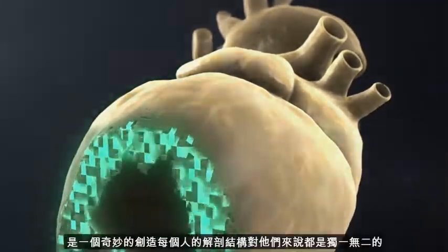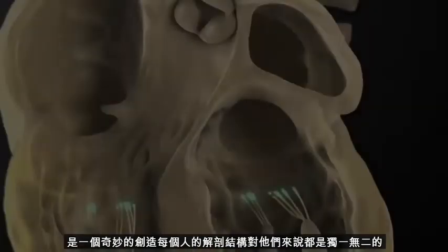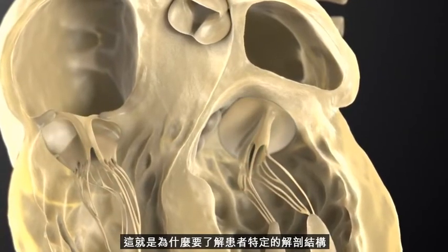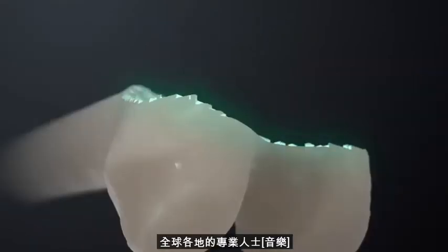The human body is a marvelous creation. Every person's anatomy is unique to them. That's why understanding patient-specific anatomy with biomechanical precision is essential for healthcare professionals across the globe.